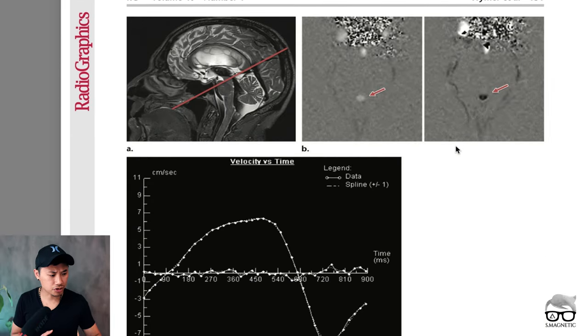On the scanner today, I'm going to show you this: the through-plane on the aqueduct. This is exactly what I'm going to show you along with the post-processing. Nevertheless, check this paper out for a better understanding. Without further ado, let's go to the scanner and I will show you.